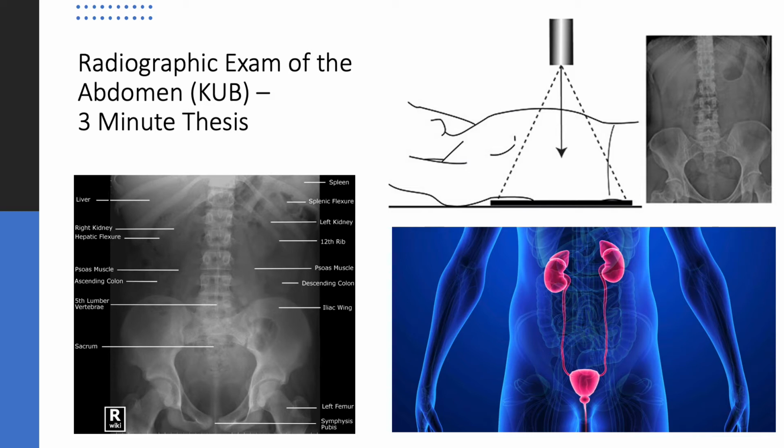The average abdominal radiograph delivers a dose of radiation to the patient equal to 75 chest radiographs, or the equivalent to 1/6 of a CT scan of the abdomen. So it is only used when appropriate, like all other ionizing examinations. The risk involving radiation dosage is outweighed by the benefit of finding out what is wrong and treating it before any severe problems may occur.